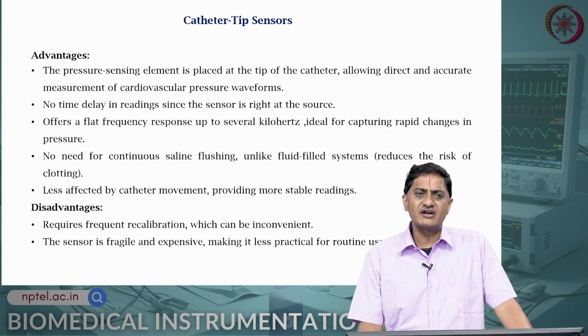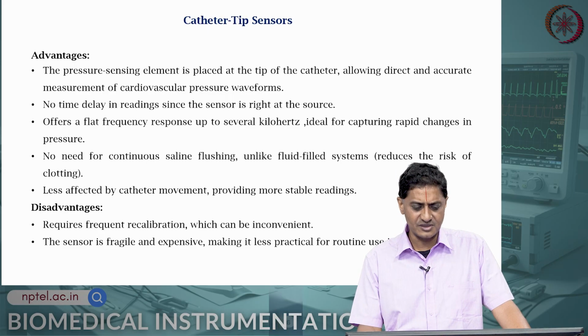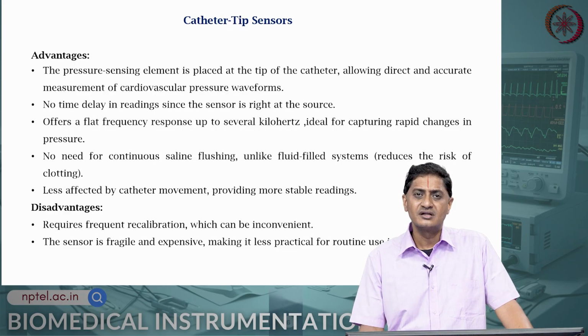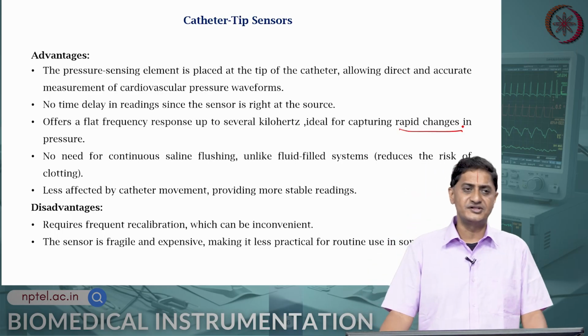It essentially offers a flat frequency response. That is, flat frequency response means the gain or the attenuation remains constant over a relatively large range of frequencies. That is what is meant by a flat frequency response. That means it can detect changes that are either very fast or relatively slow without compromising on the accuracy or fidelity of this. So, essentially it is able to capture relatively fast changes, rapid pressure changes with high fidelity.